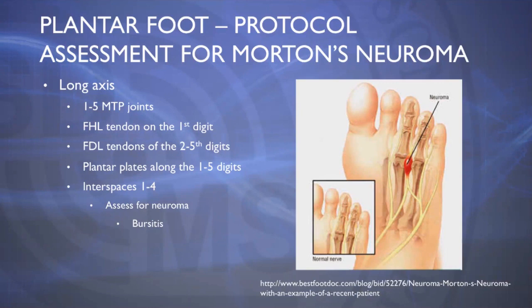Once we're done looking at those regions, we'll then adjust our depth and our focal zones to assess the interspaces of the first through the fourth areas of the foot, and looking for neuroma and bursitis.